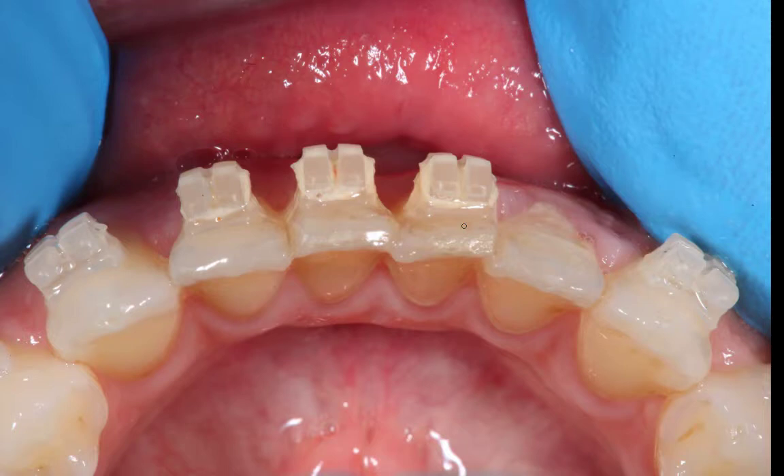Hi guys. So today I just want to show you this is a case that someone else in the practice was treating, but they were having real difficulty just straightening up this tooth here. I want to show you exactly what the problem is, because this is quite a common problem, and it's really, really easy to fix.